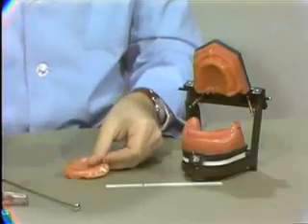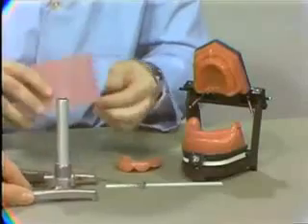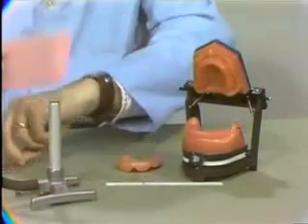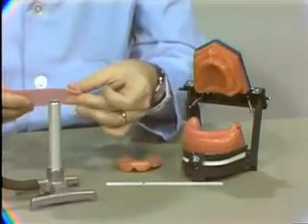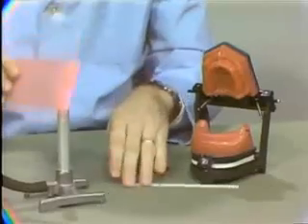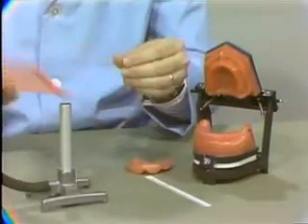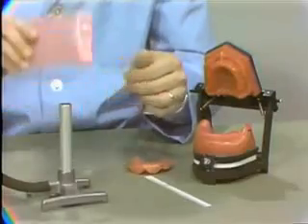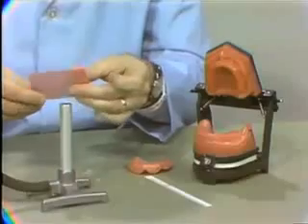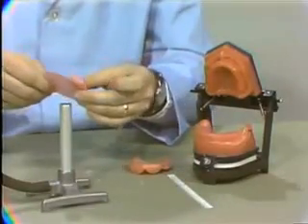So at this time, I'm going to heat up about 2/3 of a sheet of wax. And the trick here, of course, is to have the whole mass of wax thoroughly warmed, so when you bite into it, the patient comes into it with a lower bite rim, they don't have any trouble getting down to the proper vertical. If the wax gives too much resistance, we have a lot of distortion of tissues in the mouth, and this gives us faulty recordings, both in vertical registration and in centric registration.